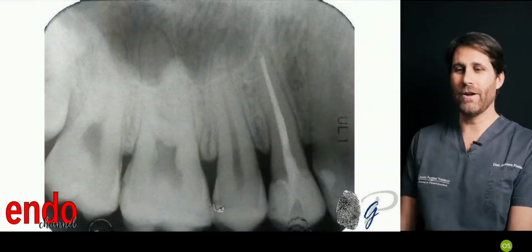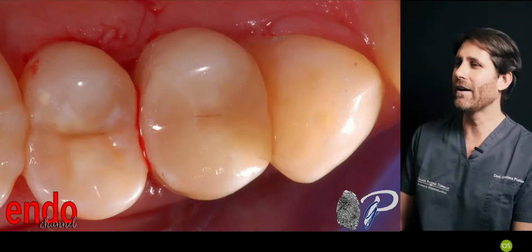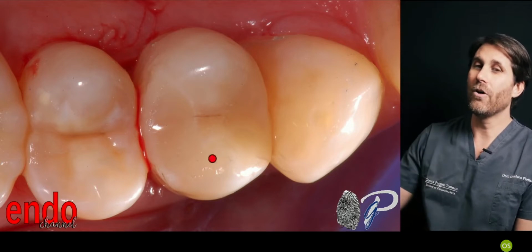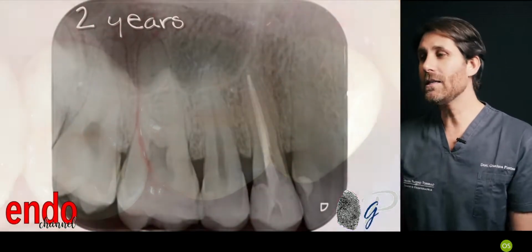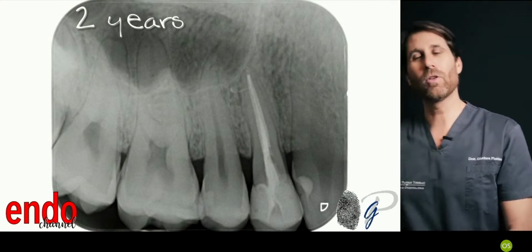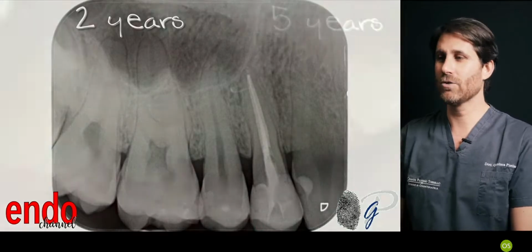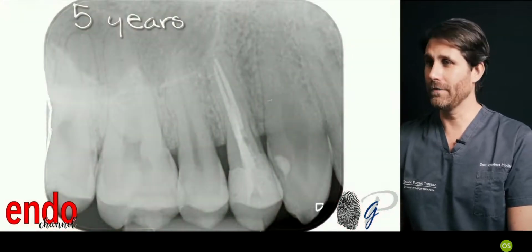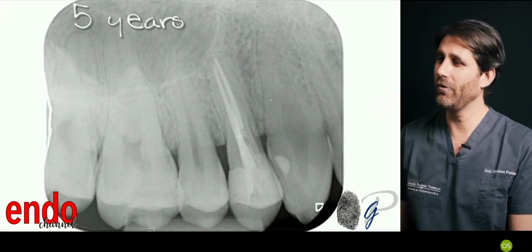And this is the final radiograph of the restorations. And this is an image of the final composites. So I imagined that this bridge of tooth in the middle may help us to maintain this tooth more in time. This is the 2-year control, lateral canals filled, so do not accept compromises in the quality of the endodontic treatment, but let's try to maintain as much tooth structure as possible. The 5-year controls and the 5-year radiographs show the stability of the situation.